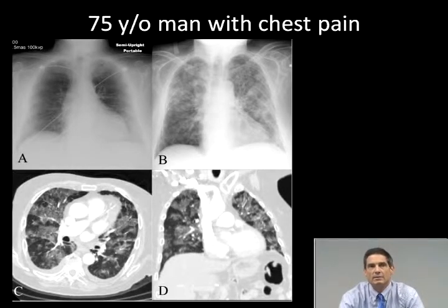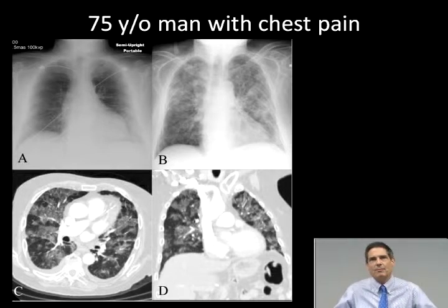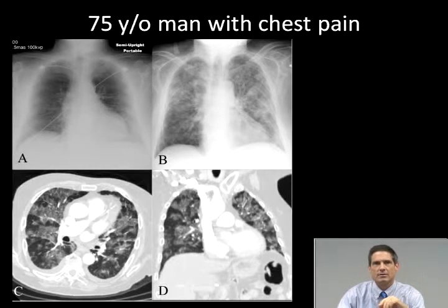Well, when the additional clinical information became clear, that this man was on anticoagulants and had a sudden drop in hematocrit and was coughing up blood, then it became much more clear that this was all representing a pulmonary hemorrhage. I think it would be difficult to make that diagnosis just on the imaging findings, but when you put all that clinical information with it, it does help a great deal.